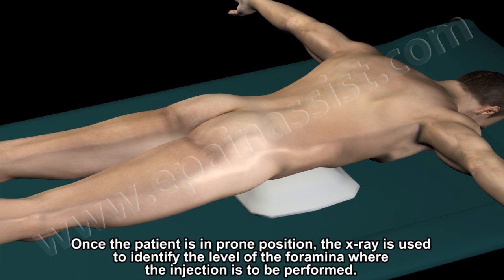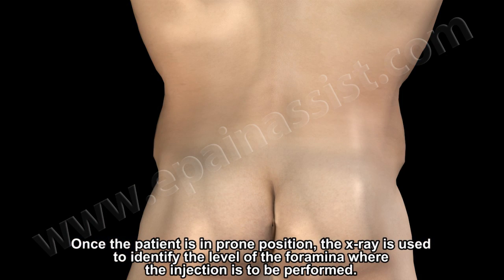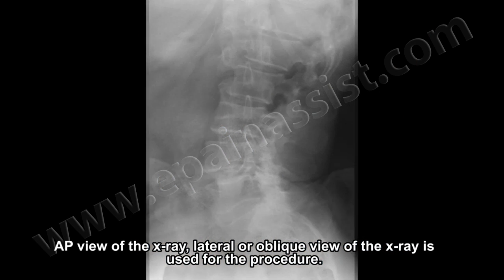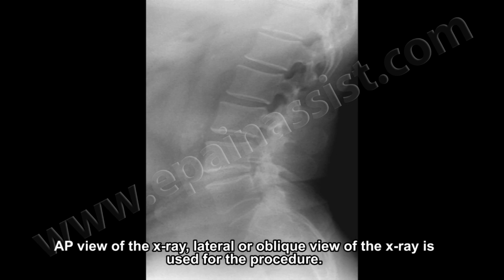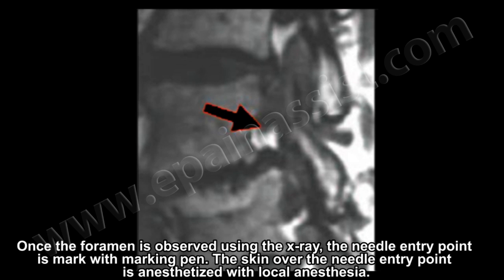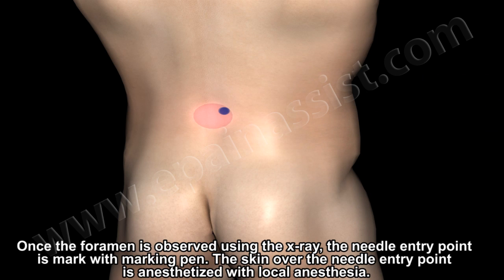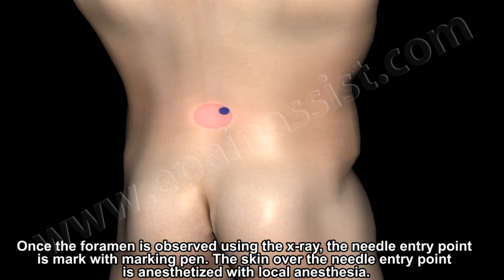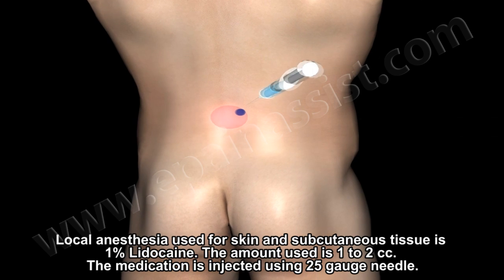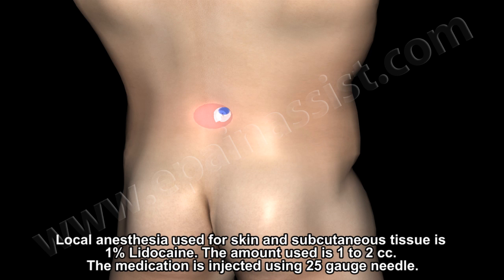Once the patient is in prone position, x-ray is used to identify the level of the foramina where the injection is to be performed. AP (anterior-posterior) view, as well as lateral or oblique view of the x-ray, is used for the procedure. Once the foramina is observed using the x-ray, the needle entry point is marked with a marking pen. The skin at the needle entry point is anesthetized with local anesthesia — 1% lidocaine, one to two cc — injected using a 25-gauge needle.